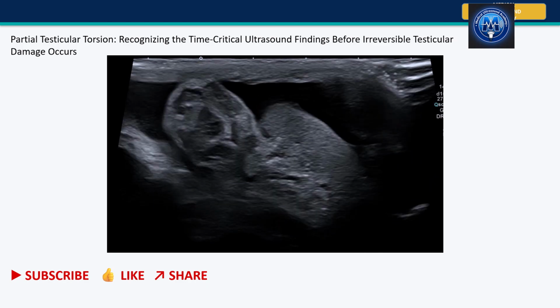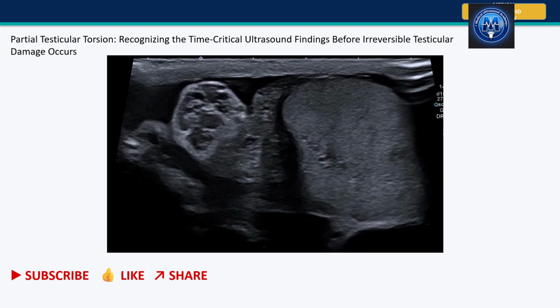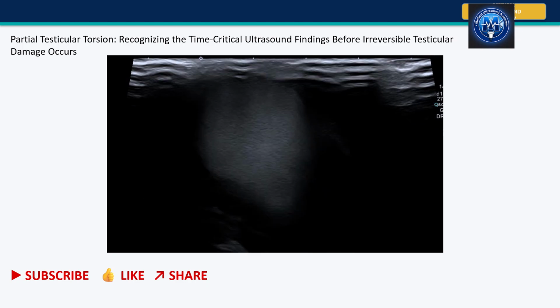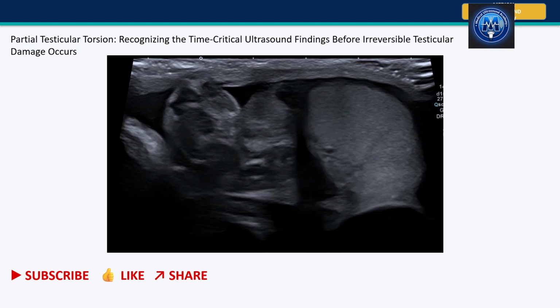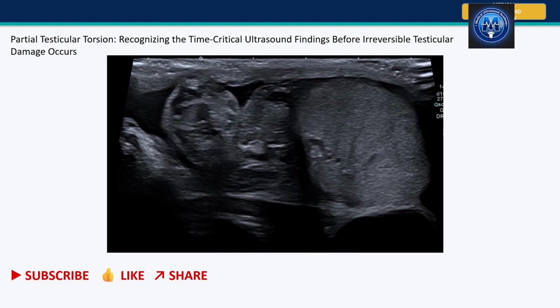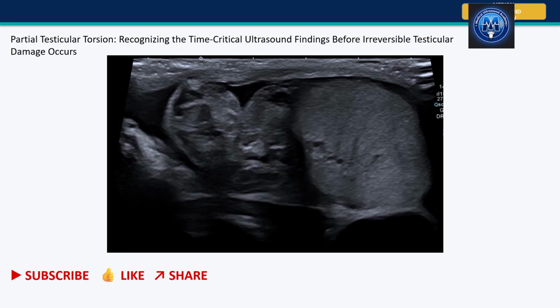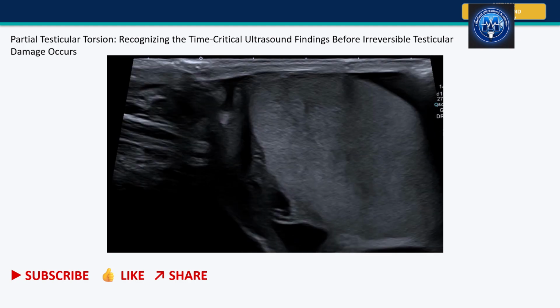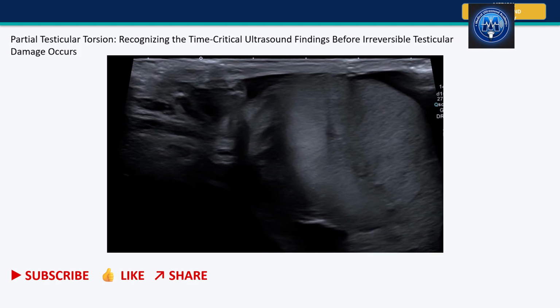You know, this patient came earlier, some months ago, for an ultrasound scan. Then I detected the cyst there, the epididymal simple cyst. Unfortunately, they didn't manage it. They just left it like that.